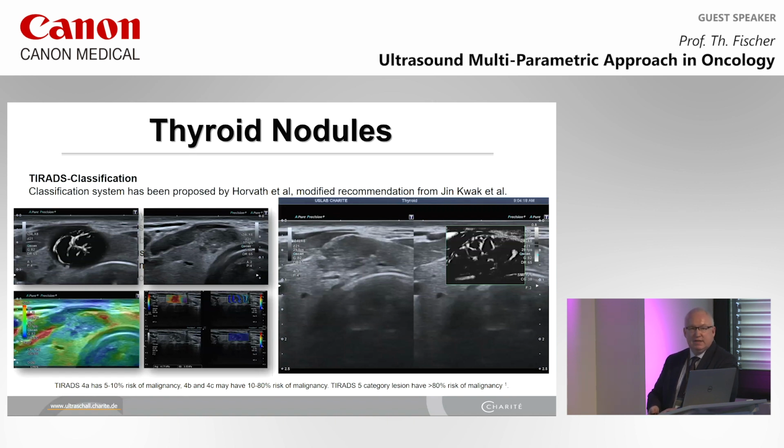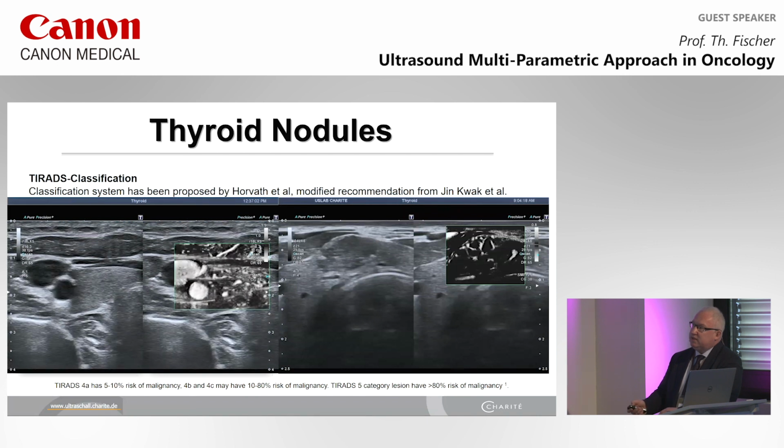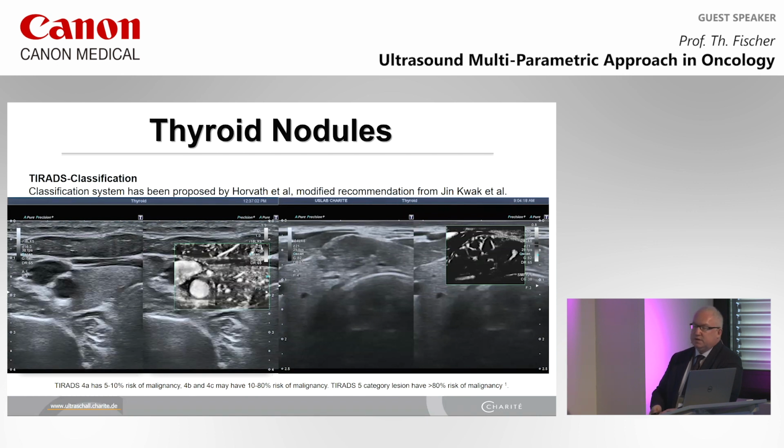And so I think there is an additional value if we use Doppler technology for thyroid nodules, but especially in a setup with SMI, in contrast here to a regular thyroid in that example, or the perfusion of the muscle, which is very well depictable based on SMI Doppler technology.